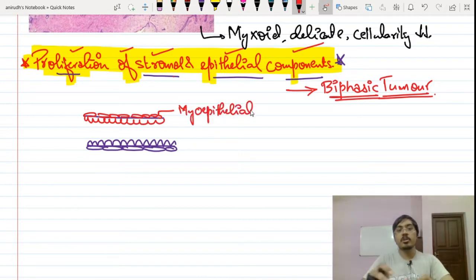Okay, so these are the myoepithelial cells. Yes, it has the property of contraction. So milk ejection is the property of myoepithelial cells. It can contract, and whatever lies inside, which is pointing towards the lumen of the canaliculi, is called by the name of luminal cells. Luminal cells, right?